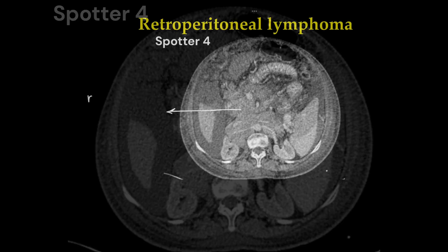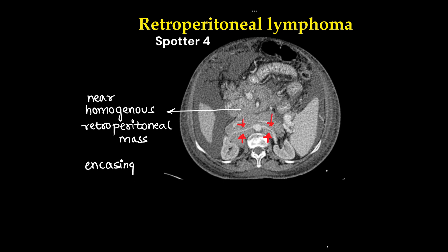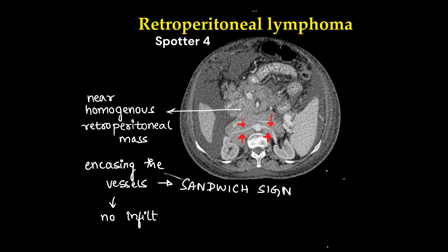This is a case of retroperitoneal lymphoma. We can see a near homogeneously enhancing retroperitoneal mass lesion which is encasing the vessels. Here we can see bilateral renal arteries encased by the tumor. The aorta is compressed by the tumor but there is no infiltration — this is called the sandwich sign.